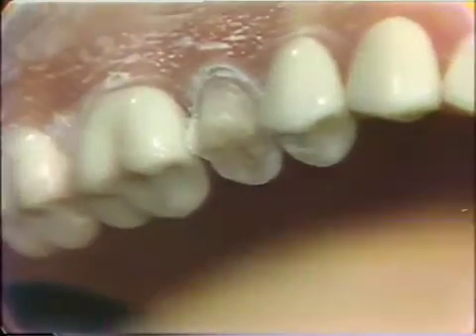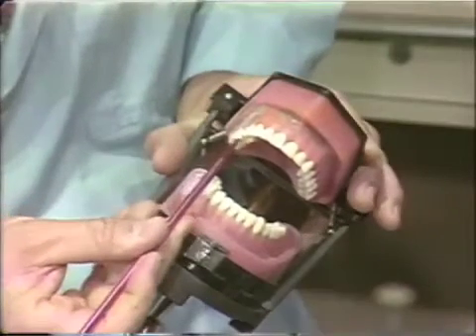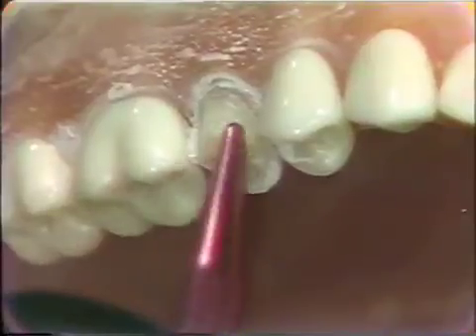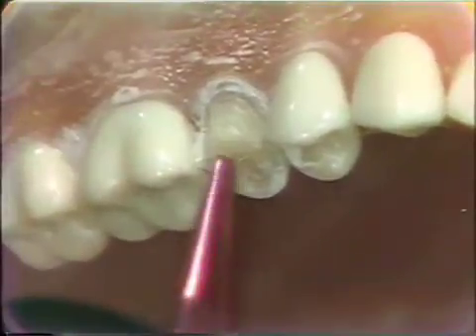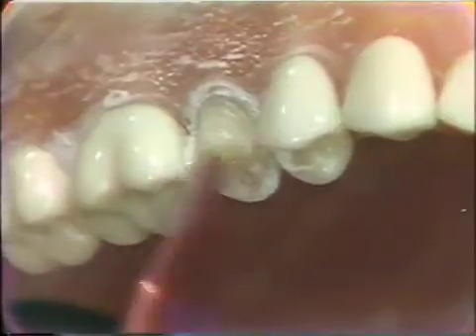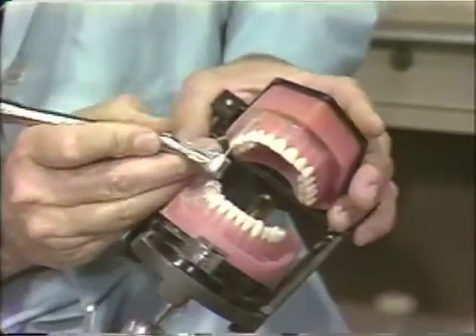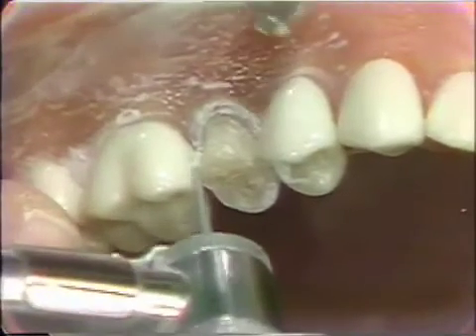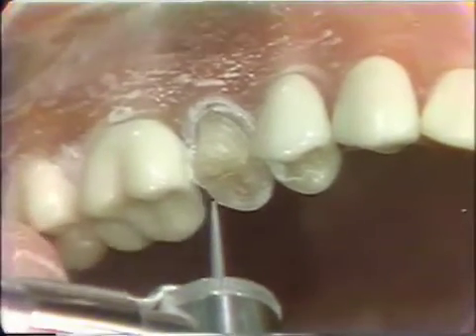The next instrument we will use is the 699-9 diamond, which will be used to slice the interproximal area. It's rather difficult to get in with the 770 or the carrot-shaped 3 quarter K diamond in this interproximal area, so the very thin diamond will be used to open up that space. If you're careful you can slice this very easily without cutting the adjacent tooth.